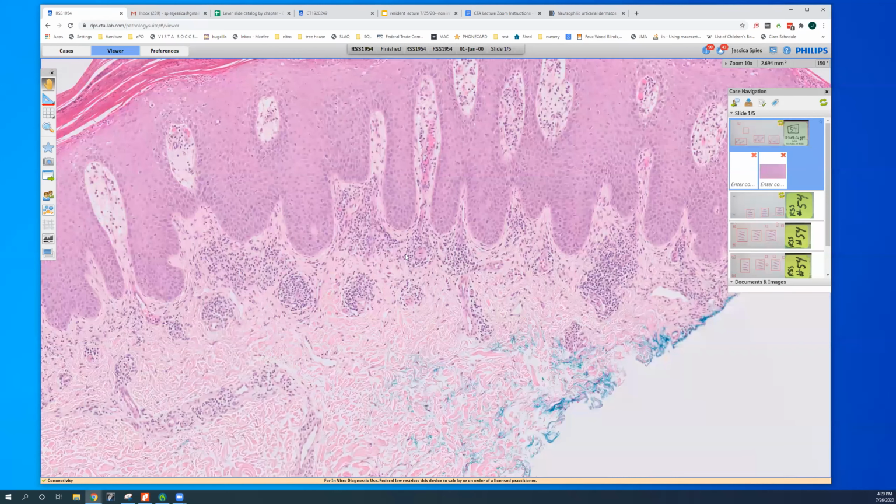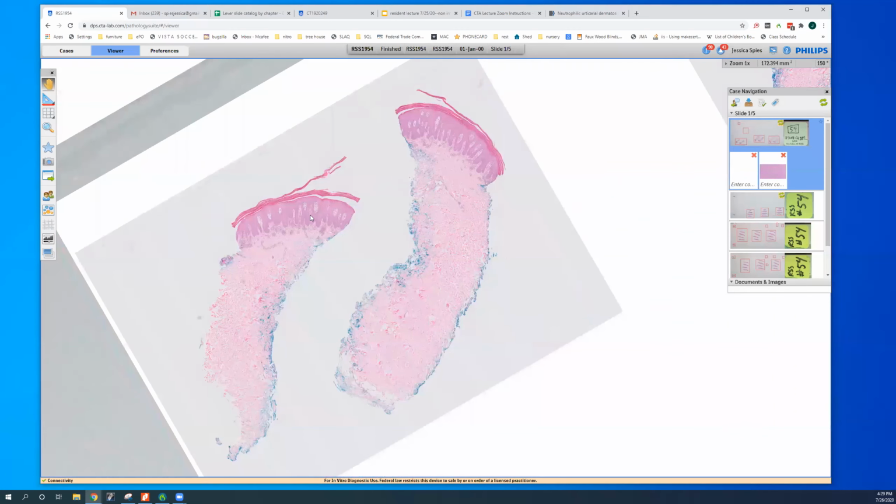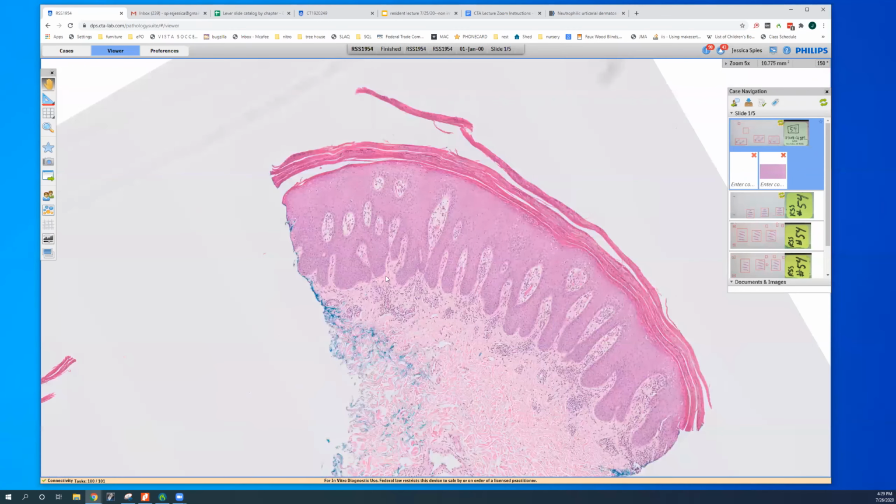There are certain variants of psoriasis that may have eosinophils more frequently, such as guttate psoriasis, and we'll look at that next. And I'm always impressed, one of the things that I think about when I look at a biopsy of psoriasis and know it's psoriasis from low power is there isn't that much inflammation compared to how much epidermal change there is, which is a contrast to a subacute spongiotic dermatitis. Usually there's a lot more inflammation when you have this much epidermal change.